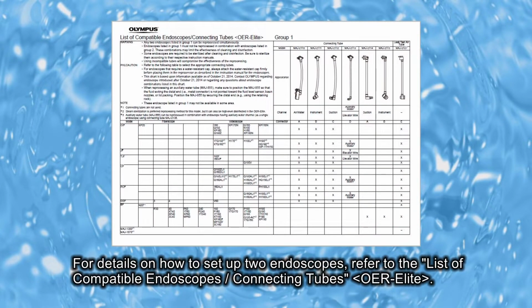The OER ELITE can reprocess specific types of endoscopes simultaneously. For details on which endoscopes can be loaded together and how to correctly load them into the reprocessor, refer to the list of compatible endoscopes connecting tubes.